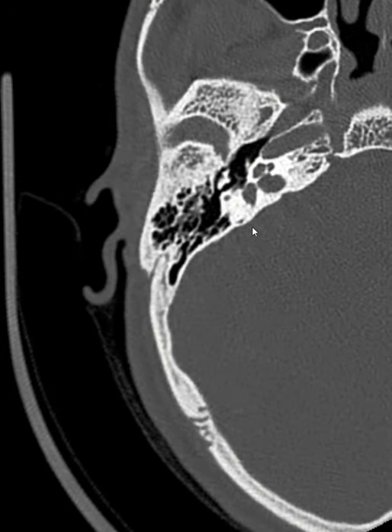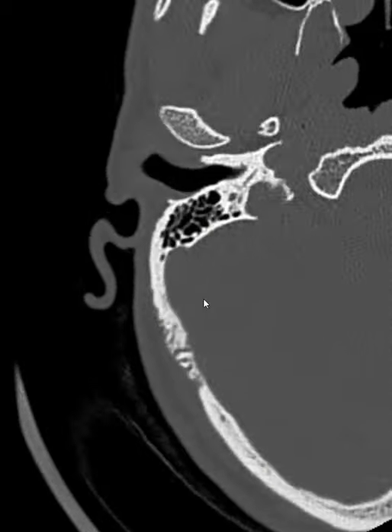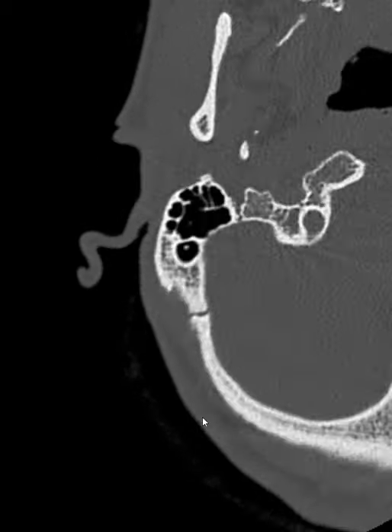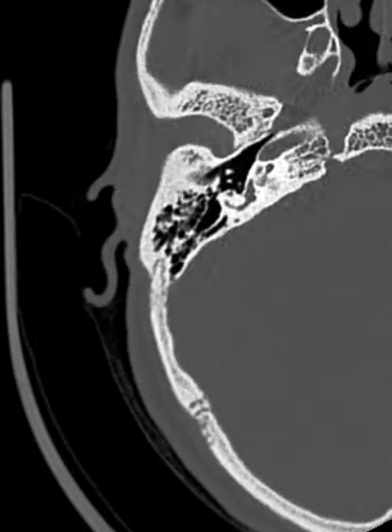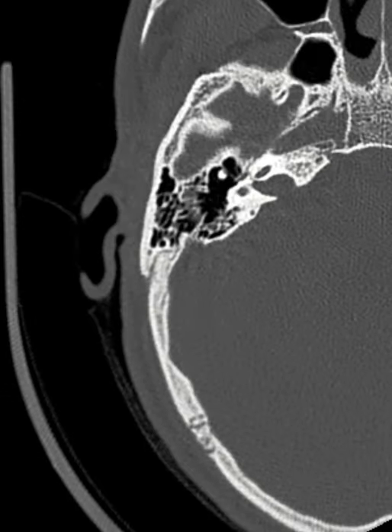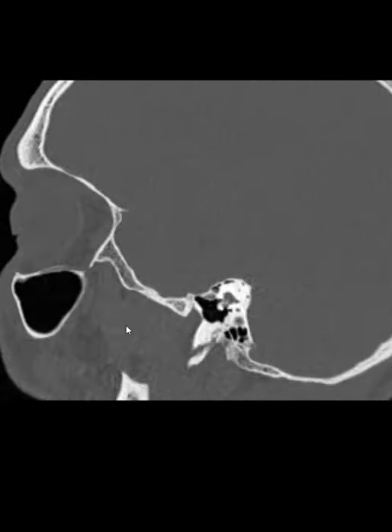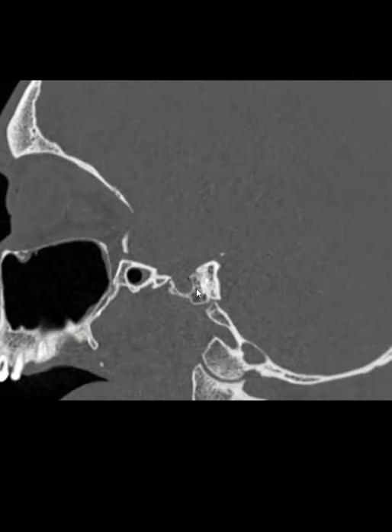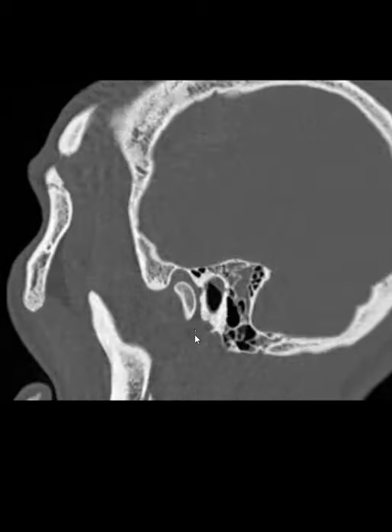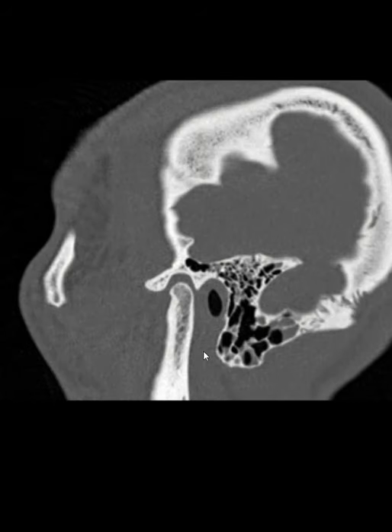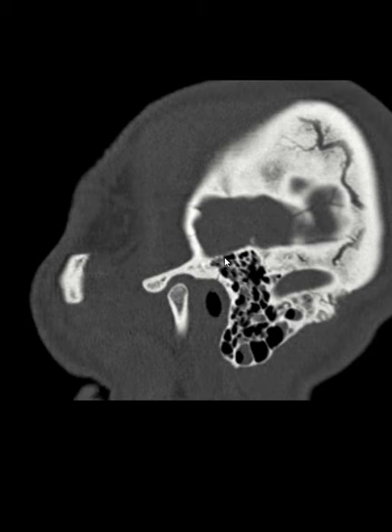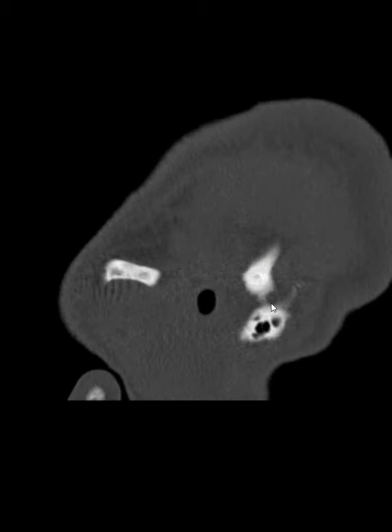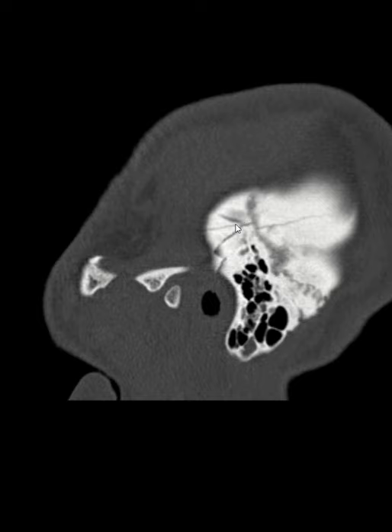The comparison with the normal right side shows exactly how it would look normally. There is no fracture line, the ear canal is normal, and there is no blood. That highlights the contrast with the injured left side.